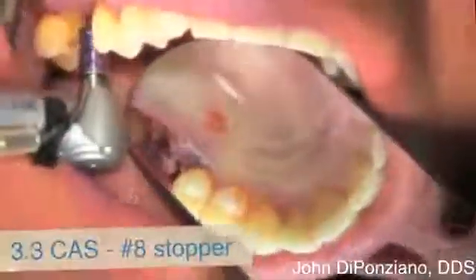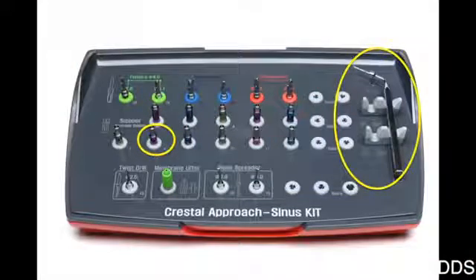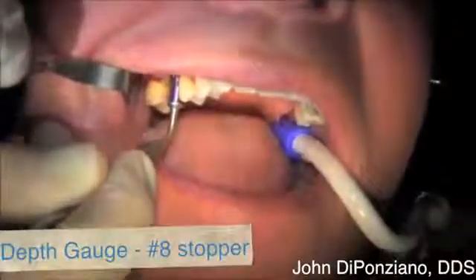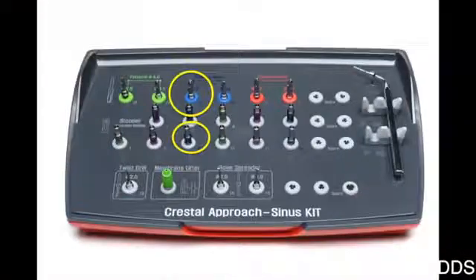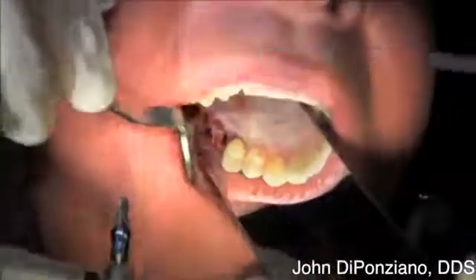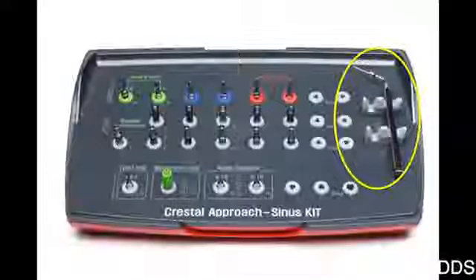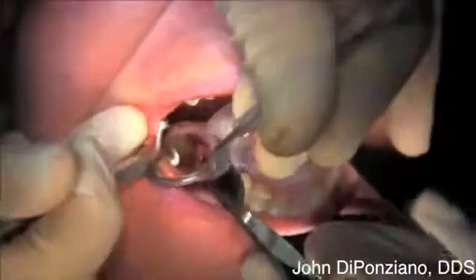Now we go to the eight. Because you have a good view of this I'm not using any depth gauge yet — I can actually see that it hasn't reached the bone. Now we're almost there; you can see some gray, so we're getting very close to the sinus. I'm going to check now with the depth gauge using the number eight stopper, and it still feels solid bone — it has not reached the sinus quite yet. So we go to the next size stopper, the number nine, using the same 3.3 CAS drill. Now I can feel that I've gotten through, and picking up the depth gauge I can feel a little bit of sponginess, like a trampoline effect — I know I'm up against the membrane.